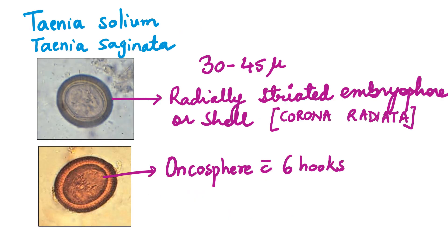Next we move on to Taenia solium, the pork tapeworm, and Taenia saginata, the beef tapeworm. The eggs are absolutely similar in intestinal taeniases due to either of them. These eggs are 30 to 45 microns in size, rounded. The hexacanth onchosphere is surrounded by a typical radially striated embryophore, also called the corona radiata. You can appreciate these radiations in the shell. So 30 to 45 microns, radially striated embryophore enclosing the onchosphere with six hooks — both eggs are absolutely similar.